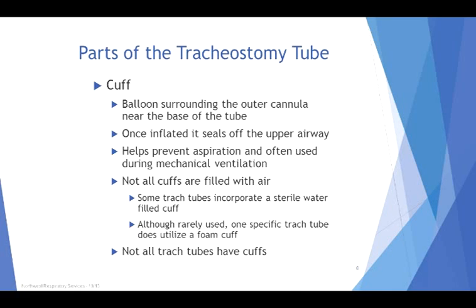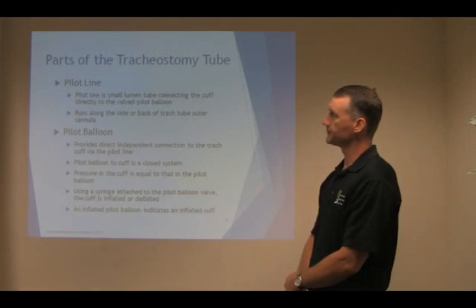There are some that incorporate sterile water, there are some that are foam, and some that have air. So we need to know exactly which tube we are using so we don't put the wrong product in the cuff. And not all trach tubes have cuffs.